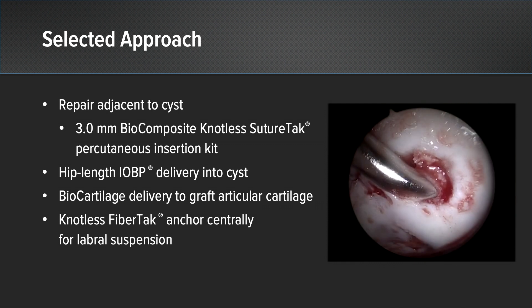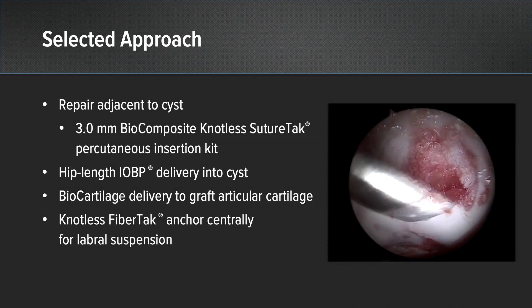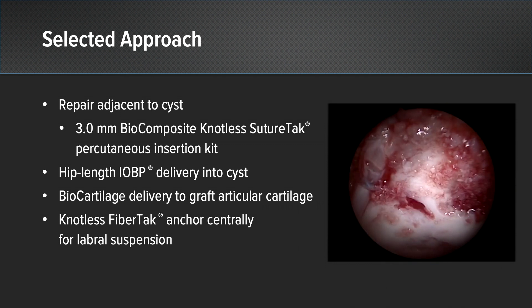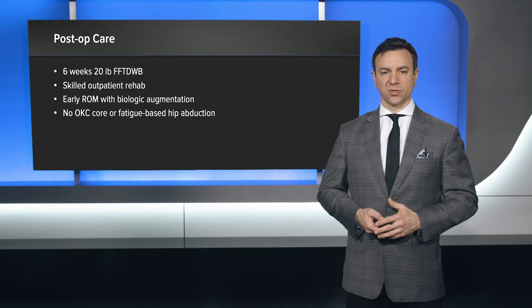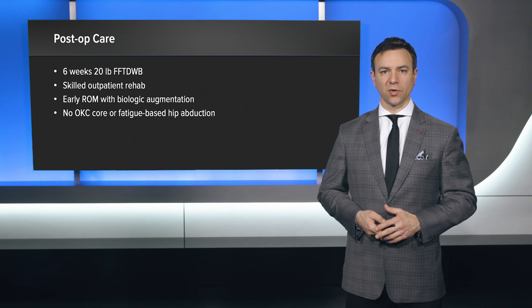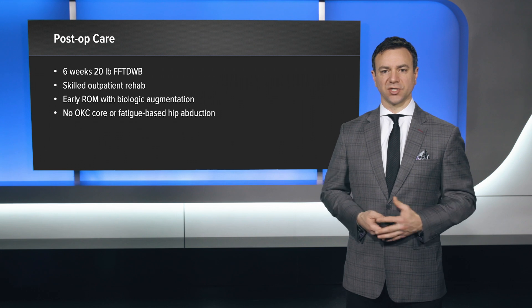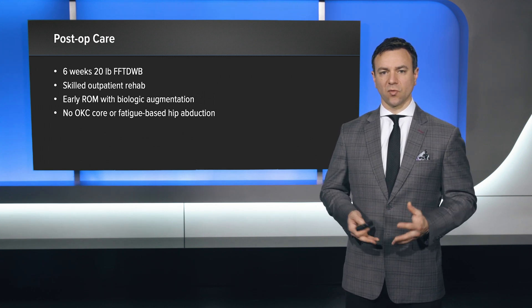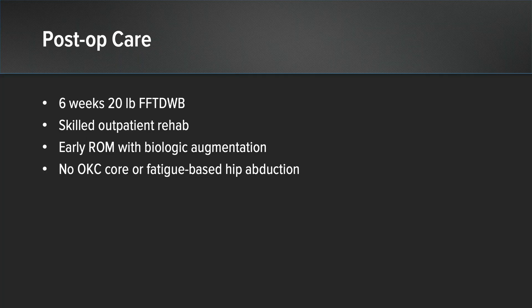After the dual grafting was complete and matured using fibrin glue, a knotless fiber tack was placed just above the drill tunnel from the IOBP needle to create a central suspension in the labrum, further stabilizing the final repair construct. Post-operative care was initiated immediately after surgery with early range of motion. Hips in general provide an intense biologic healing response, made even more aggressive by bioactive substrates, so early range of motion is extremely important. Protected weight bearing was utilized for the first six weeks of foot-flat touchdown weight bearing. Skilled outpatient rehabilitation is crucial to ensuring an optimized outcome.